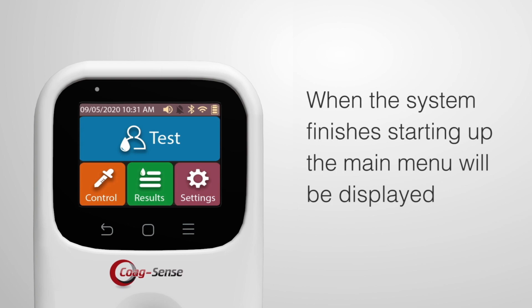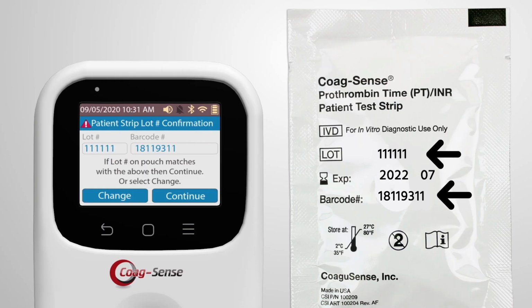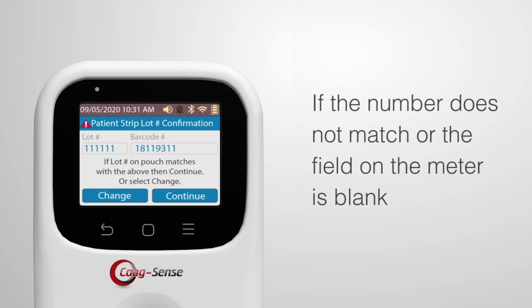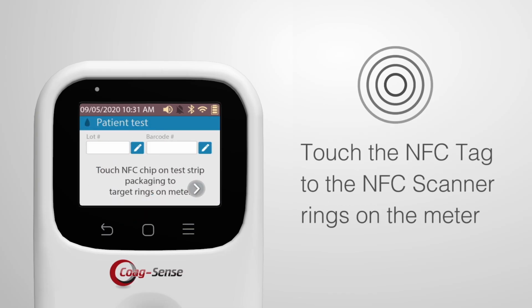When the system finishes starting up, the main menu will be displayed. Press the test button. Confirm that the patient strip lot number and barcode number display matches the information on the test strip pouch. If the number does not match or the field on the meter is blank, then touch NFC tag to the NFC scanner on the meter.